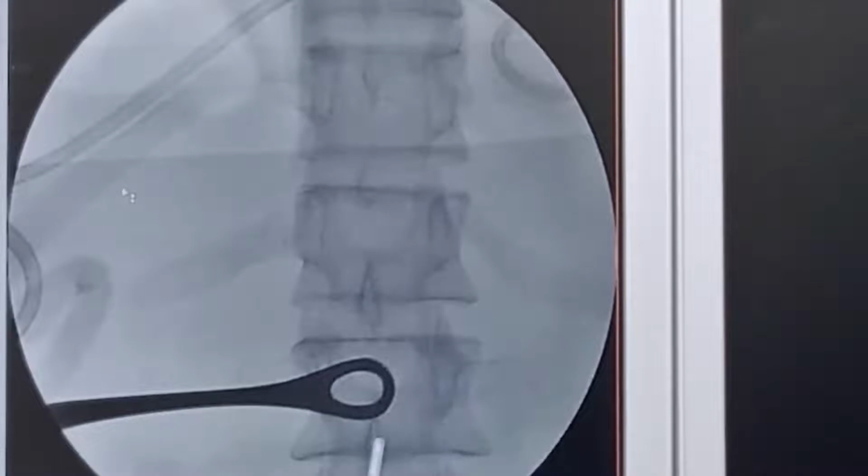The spinous process of the L1 vertebra is almost in the middle of the vertebra, along with the pedicles which are onto the sides. And this is the transverse process of the vertebra.